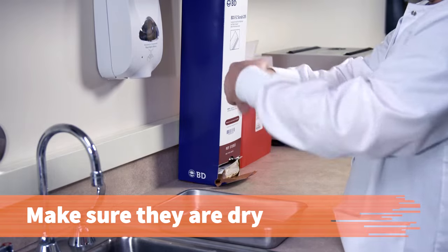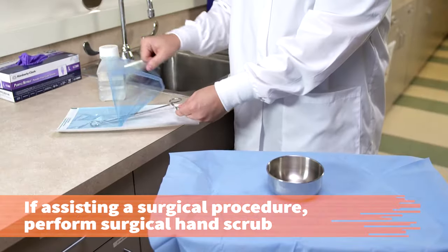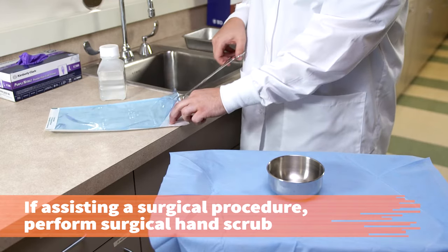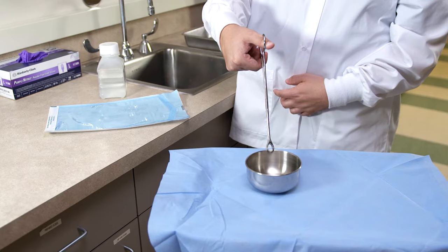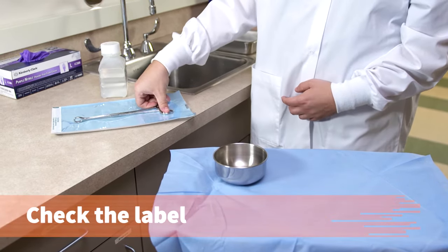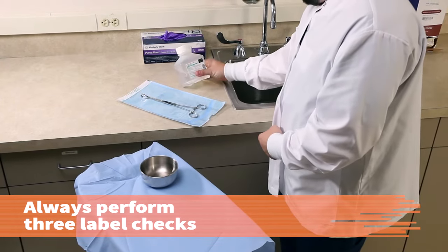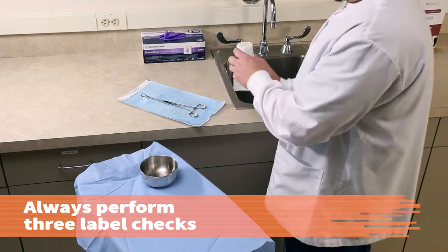Moisture on your hands may contaminate the pack. If you will be assisting with a surgical procedure immediately after this procedure, perform a surgical hand scrub. Use the transfer forceps to move the bowl to one inch from the edge of the sterile field. Check the label of the ordered solution. Always perform three label checks before administering any solution or medication.